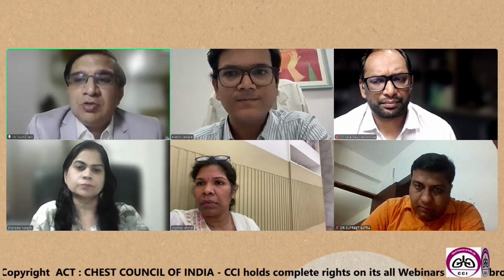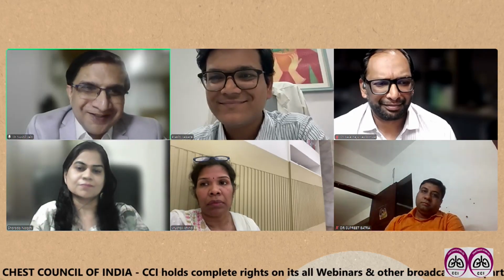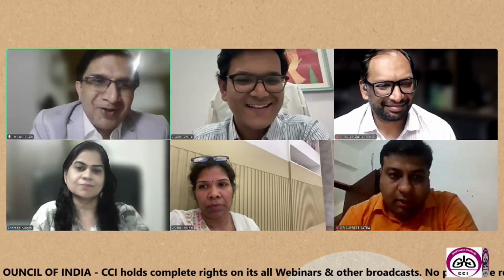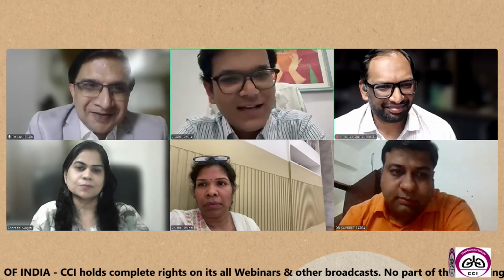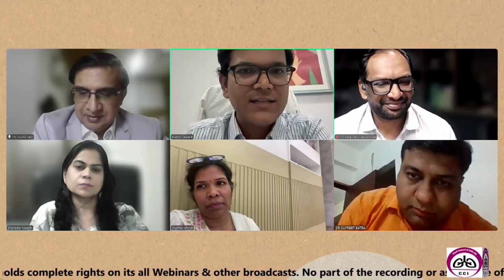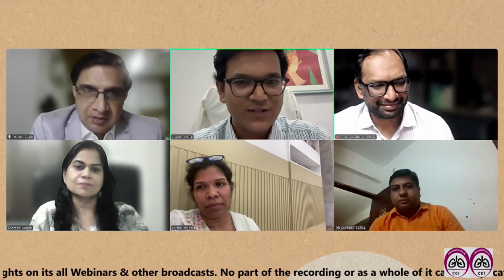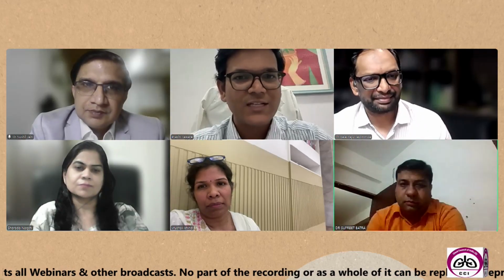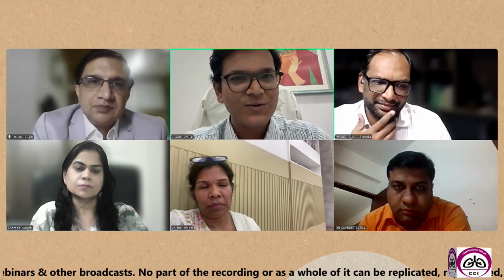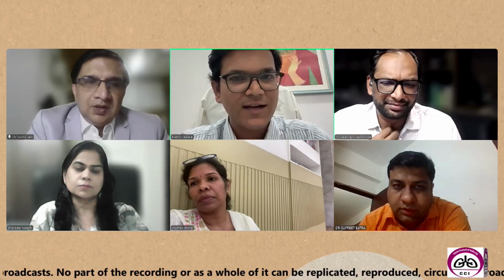There's a question from the audience: if you get 2 good cores, do you still need 4 passes, or will you restrict to 2 only? Yes. So again, sir, even if you suspect malignancy, in our country you need to make sure you are sending for microbiology. So for GeneXpert and for AFB culture, you need those 2 extra cores. So always make sure you get enough sample.